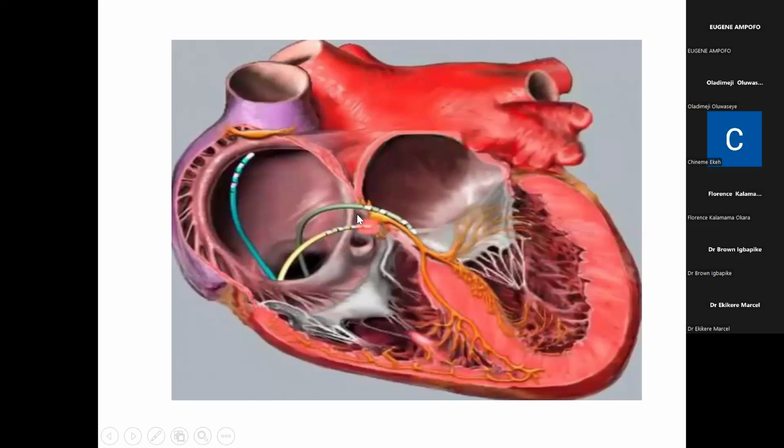So you can see it has the property to sense activity in the atrium here. It has the ability to sense the activity going to the ventricle here, right? Because it's just touching, it's in between. Just like your CS catheter is in between left atrium and left ventricle, so also your HIS catheter is in between your right atrium and your right ventricle.